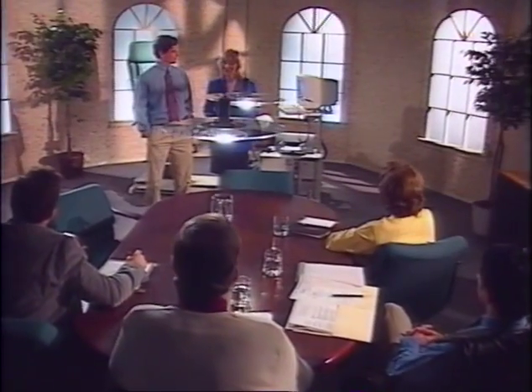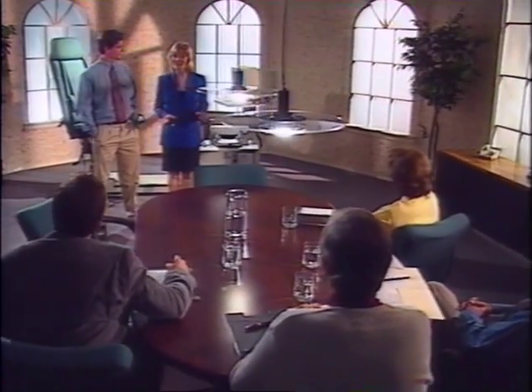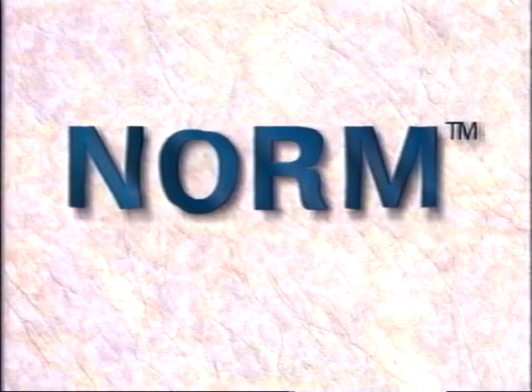Well, we promised you a new concept in testing and rehabilitation. NORM is the most radical improvement in a testing and rehabilitation system that's ever been introduced. And it's from CYBEX.